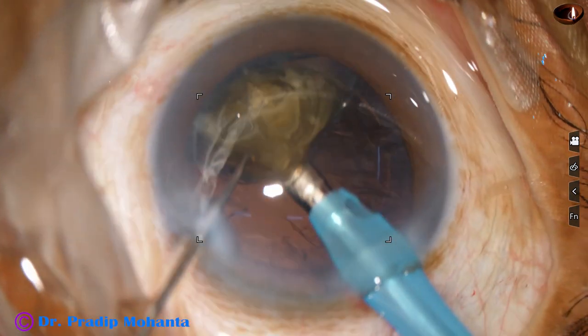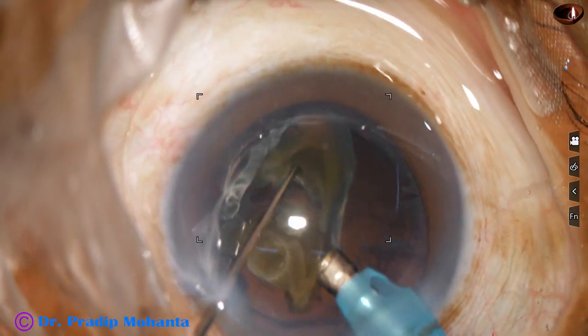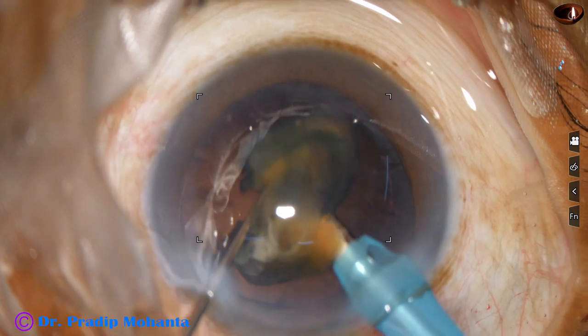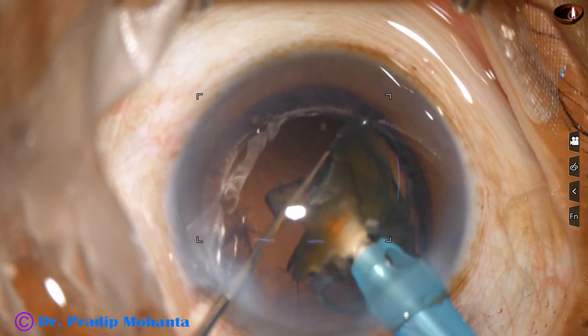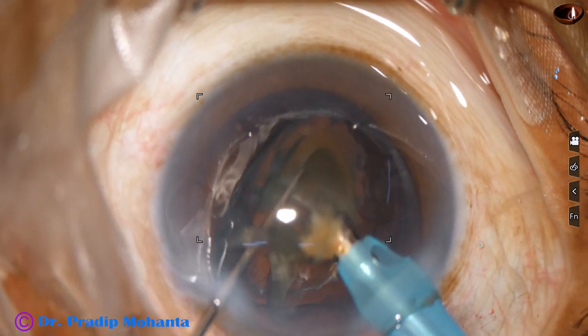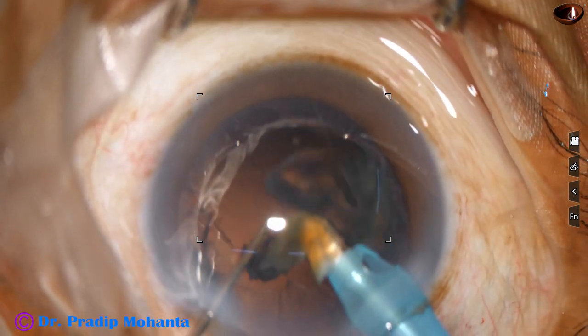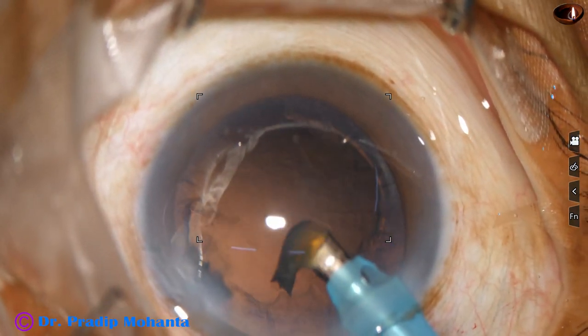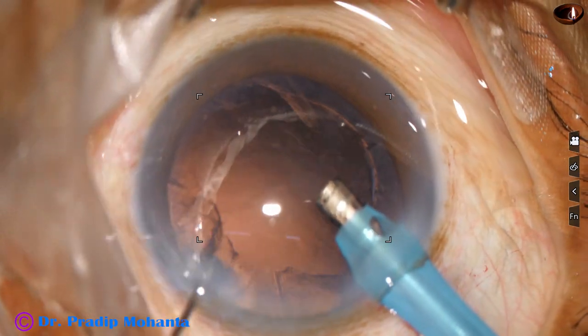Now this is the last nuclear piece. At this time, the ultrasonic energy remains the same. Flow rate is 25 and vacuum is 250 millimeter of mercury. And it is done. The nucleus is nicely managed.